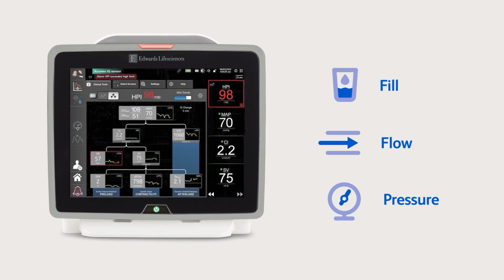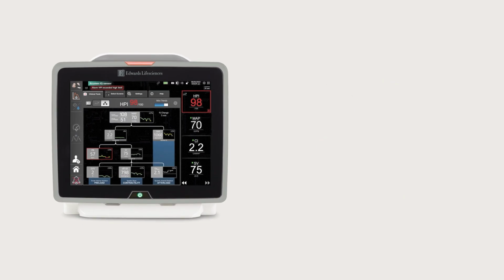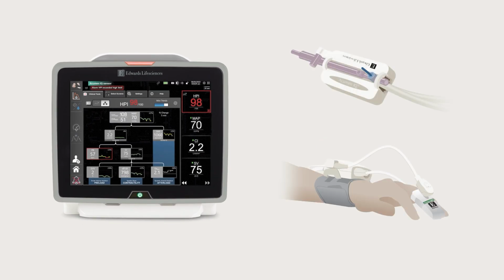I hope you enjoyed this guide to optimising the circulation using the HemoSphere monitor and Acumen HPI software. Acumen HPI software can be used via the arterial line sensor or a non-invasive finger cuff.